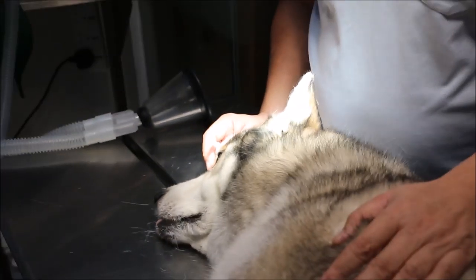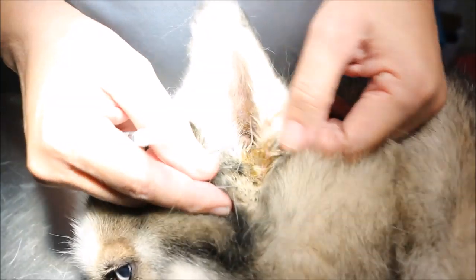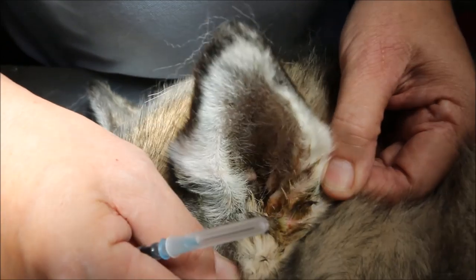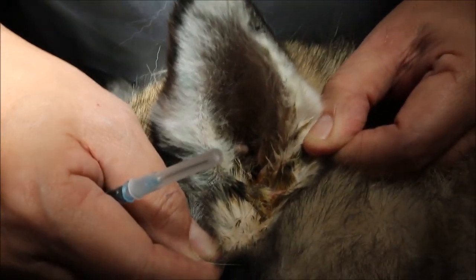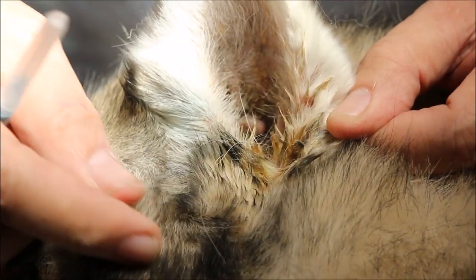This is a case of chronic otitis externa. The treatment of this very badly infected, pus-filled, smelly, and painful ear canal is by ear irrigation.